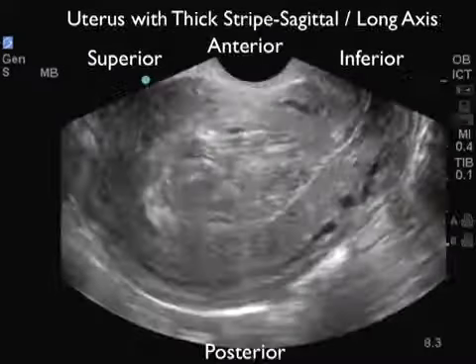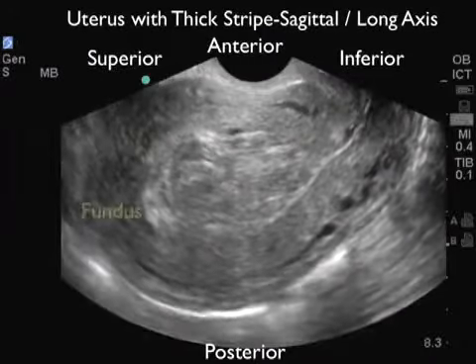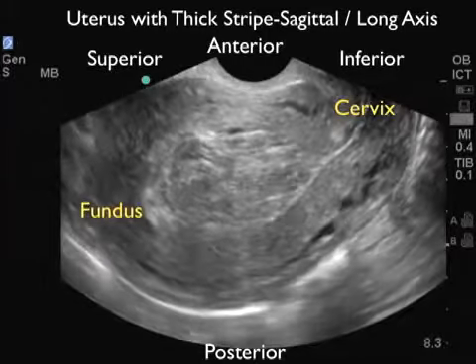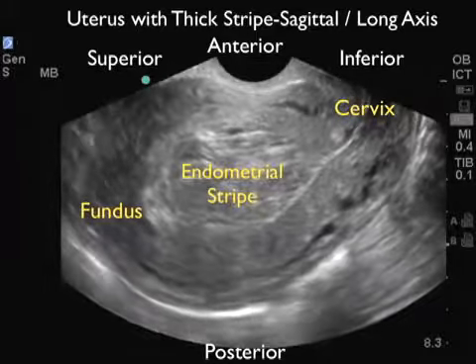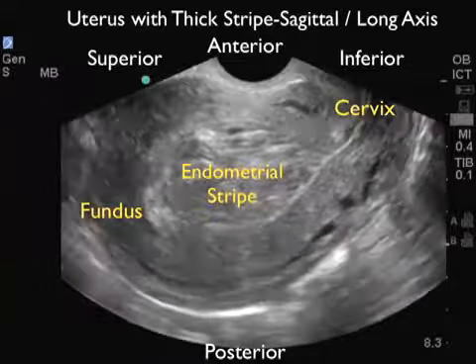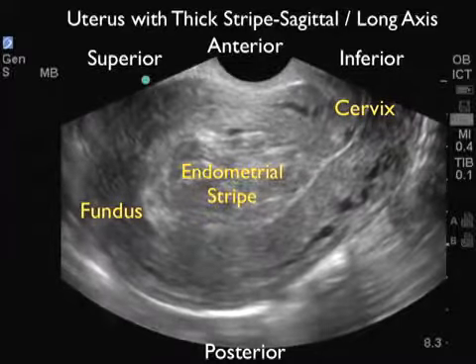menstrual period. Here's another ultrasound image showing a long axis scan through a female uterus in a patient who had recently undergone a voluntary termination of pregnancy, or a VTOP. Our patient had experienced continued bleeding after the procedure, and note here the very thickened endometrial stripe greater than 2 centimeters in diameter. Very suspicious for retained products of conception as a cause of our patient's continued bleeding.